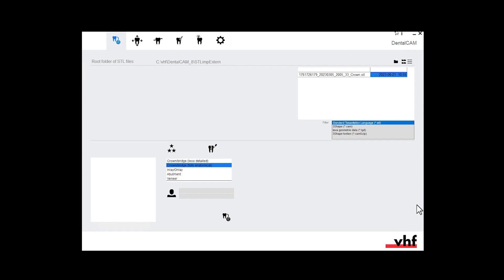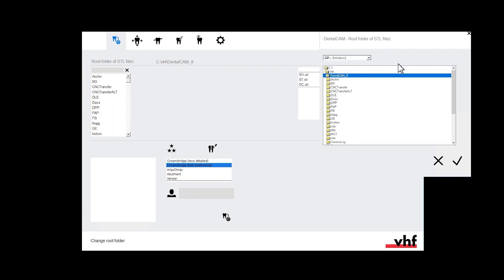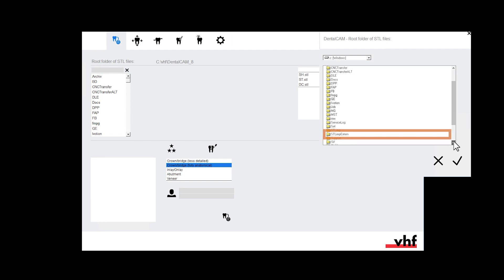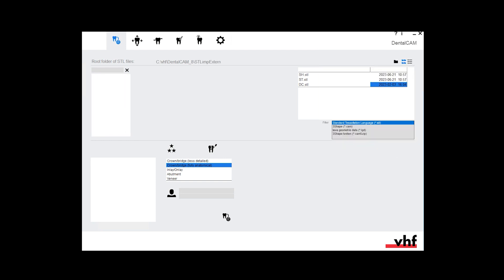Change the STL root directory. Open the STL import view. Activate the root folder. Specify the root folder. Navigate to the DENTALCAM installation folder on the C drive and open the STL-IMP extern folder. Do not only mark the folder, but open it. Refresh the file list.